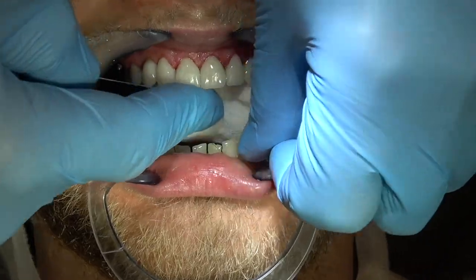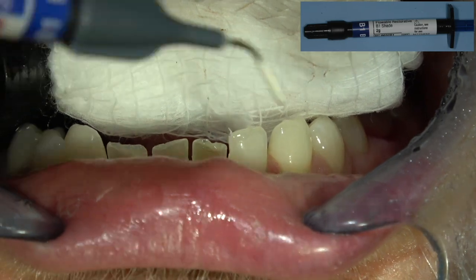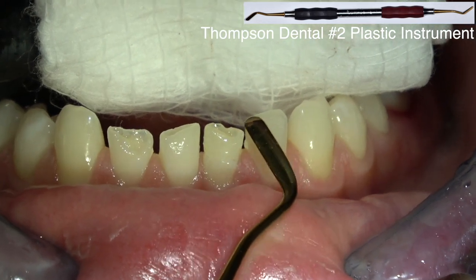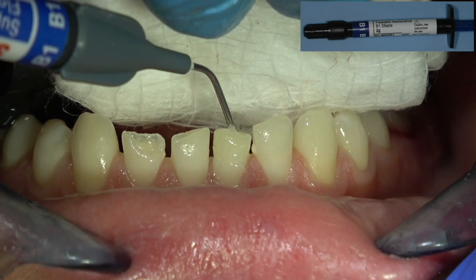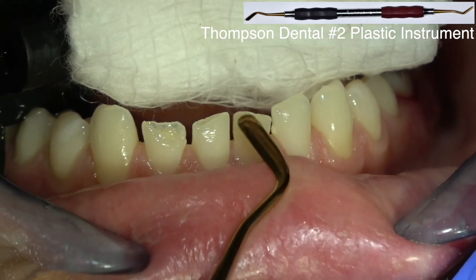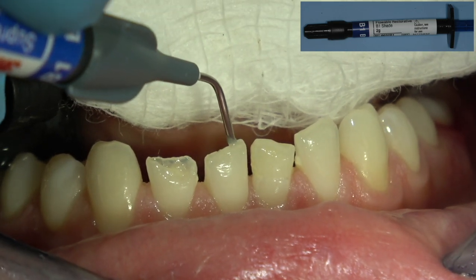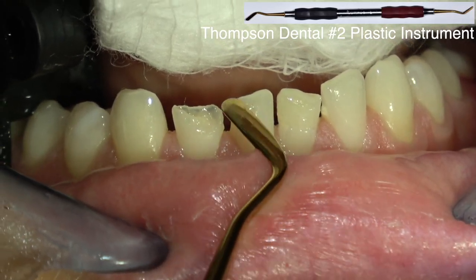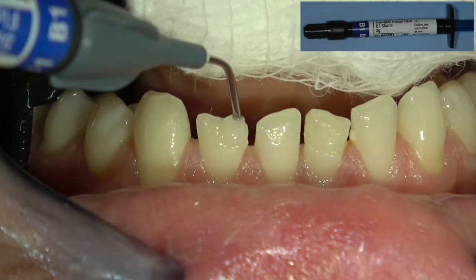Then with direct composites, always cure the unfilled resin or the primer adhesive after you've blown it off, prior to placing the filled resin. And you only need to cure the unfilled resin for about 5 seconds. And this is flowable composite. A night guard is so important with any anterior restorations. And I'm going to cure those for 60 seconds per restoration. I'm going to cure the unfilled resin or the primer adhesive for about 5 seconds. Then I'm going to cure the filled resin or the composite for 60 seconds.